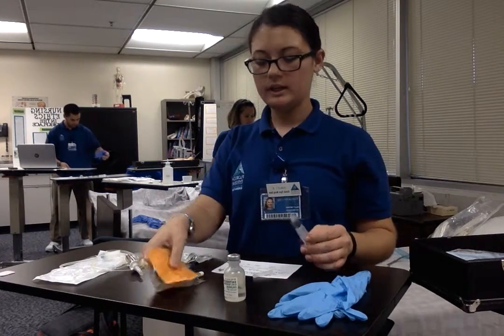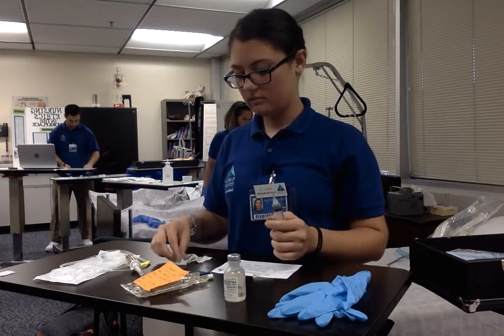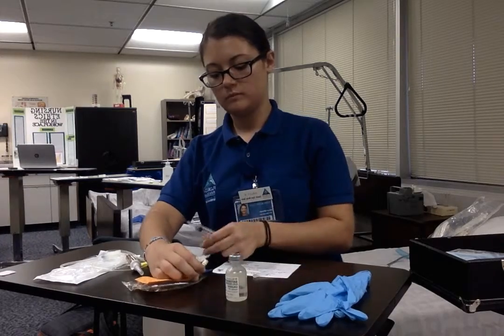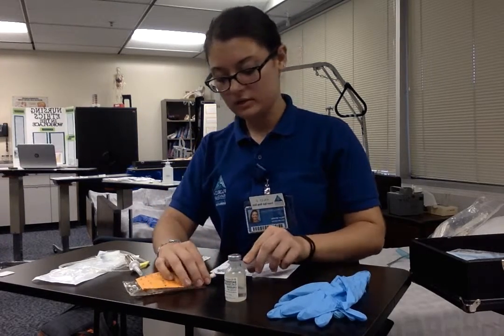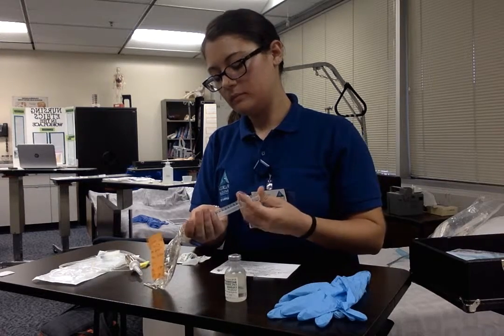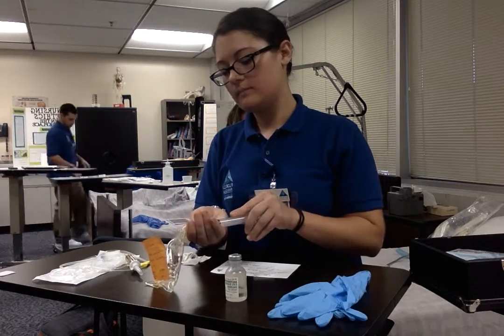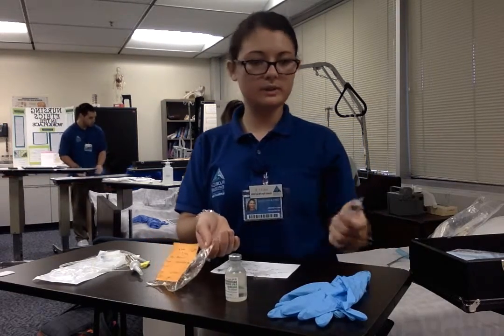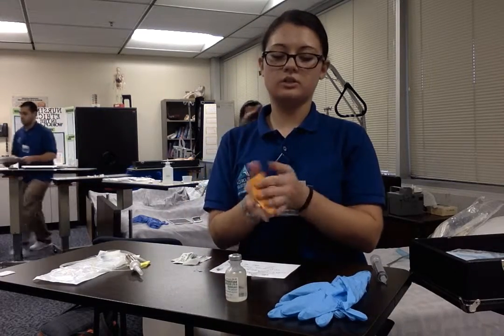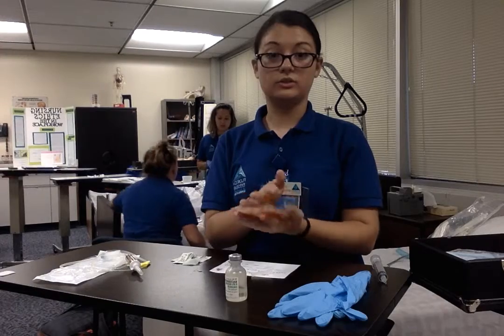And I'm going to go ahead and carefully with my blunt tip the white part of the cap, which since I just touched, I'm going to go ahead and make sure that's clean. But I would have just taken it out of the bag. So I'm going to carefully inject that in, put in my medication. Alright. I'm going to go ahead and put this into the sharps now. And I'm going to go ahead and just gently mix my medication together. And I don't see any reactions going on or anything.